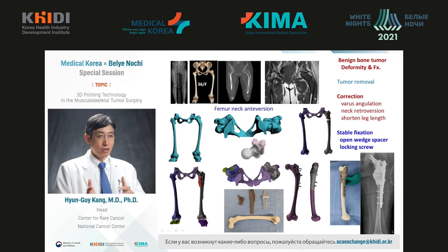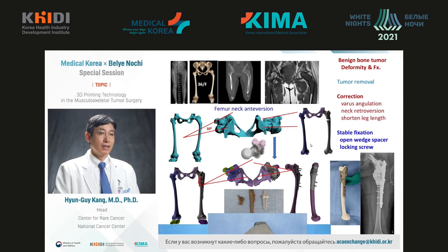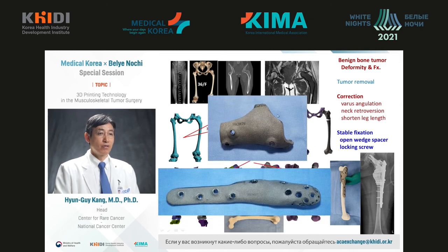Another patient, 36 years of age, had a benign bone tumor with fibrous dysplasia. She had varus deformation, neck retroversion and shortening of her leg. The fracture was not healed during 6 months. We removed not just the tumor, but also completely corrected the deformity using 3D printing technology. In the middle part, we used an open wedge spacer, and a wedge plate in the lateral part.